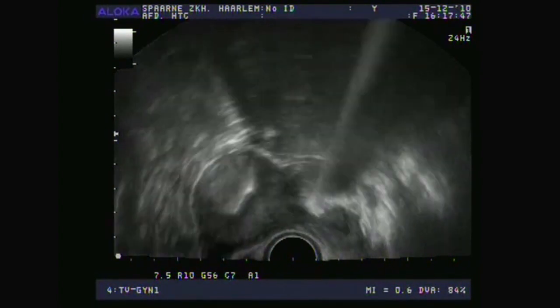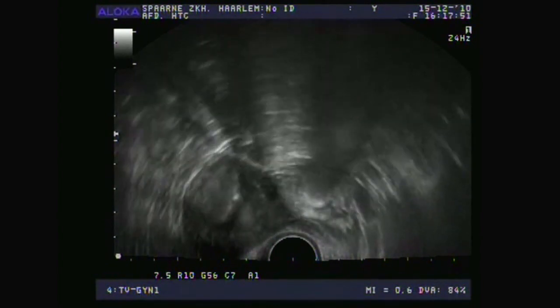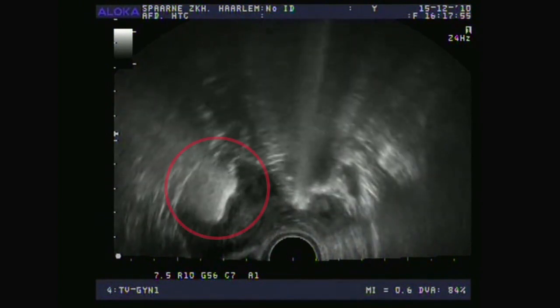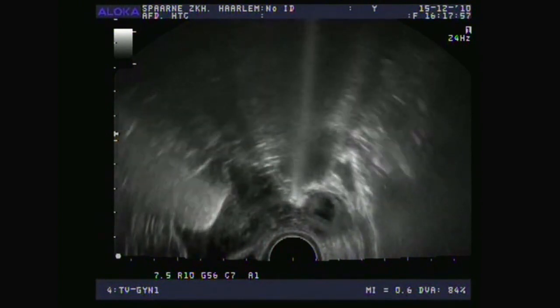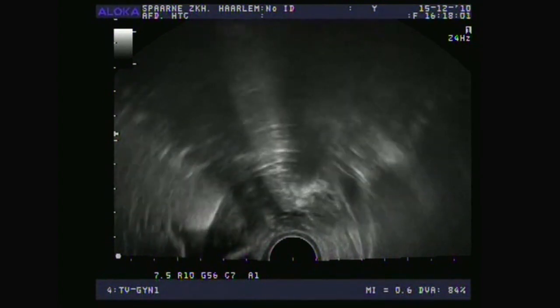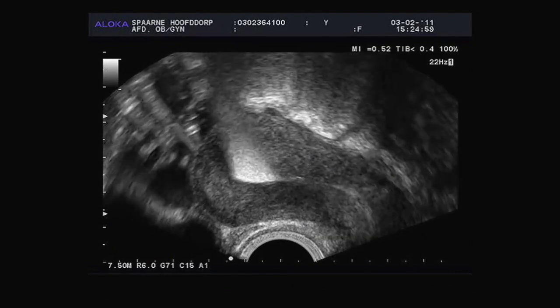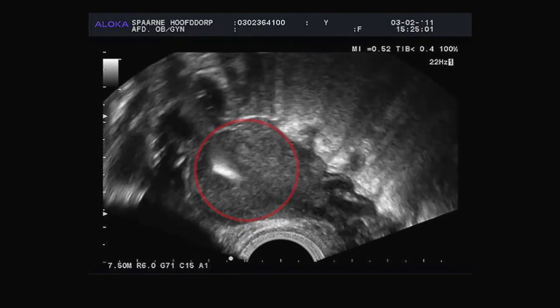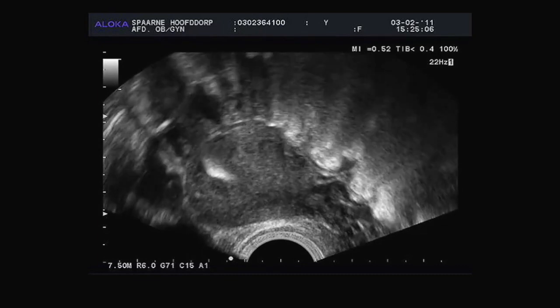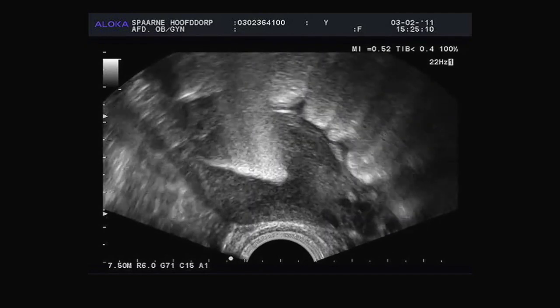On this side, this fallopian tube cannot be viewed so well as it winds a lot, but you can see clearly that the foam is appearing next to the ovary. And look here — here you can see that nice long white line, the fallopian tube. I keep turning the tip to follow the foam. The foam fills up to the fundus, and now we move a little bit to the side and from longitudinal to transversal, and then you can see the first fallopian tube come up immediately.